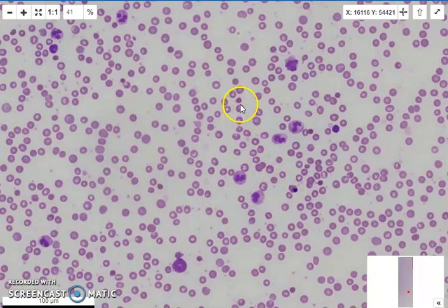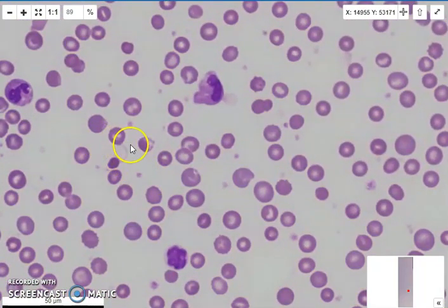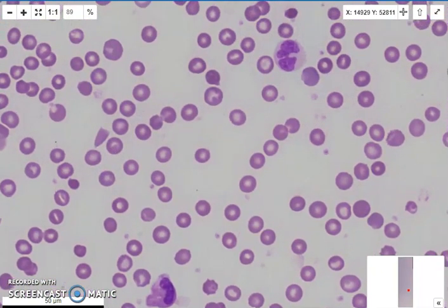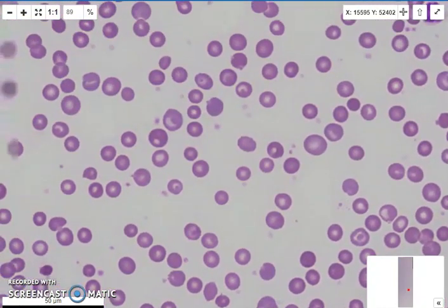And what you might start to see, these cells here, and you might start to think that you have spherocytes. You look around, you'll find quite a few of them. But if you look really carefully, they are not perfectly round. They have this blister appearance to them. And this is where that Heinz body has been pitted out by the spleen and the membrane has rejoined. So we have almost an unequal hemoglobinization of these cells. They're no longer perfectly round, and you can almost see where they've been pulled and where that spleen has pitted out those Heinz bodies and formed those bite and blister cells.